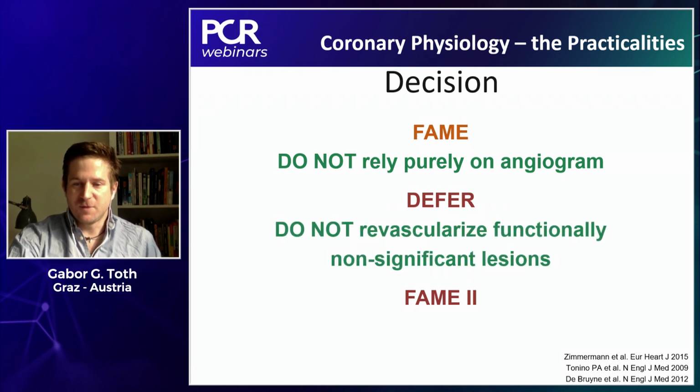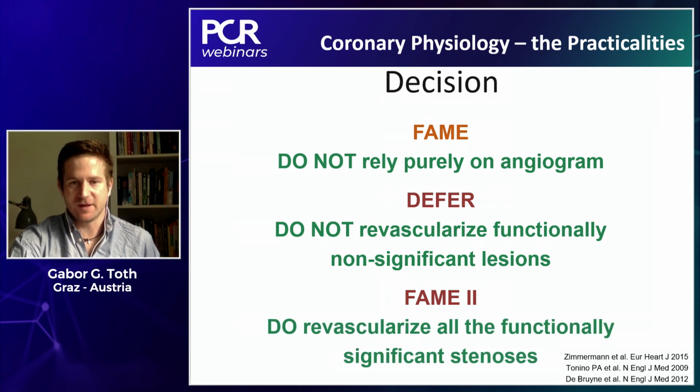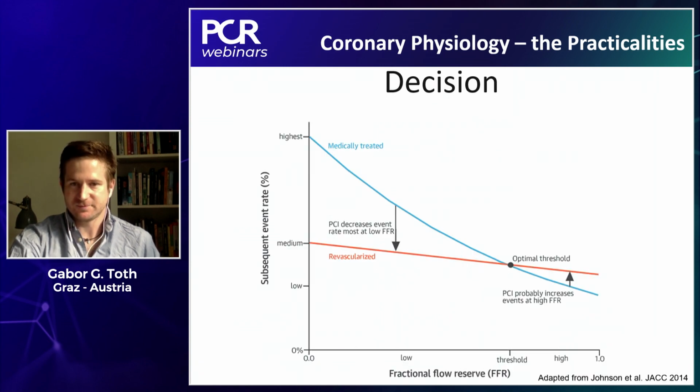And you measure the FFR, and you do not revascularize functionally non-significant lesions. This is why you did the measurement. You want to understand, and if you got a non-significant value, you have no reason to do revascularization. On the other hand, if you measure a significant value, this is a very good argument to perform revascularization.